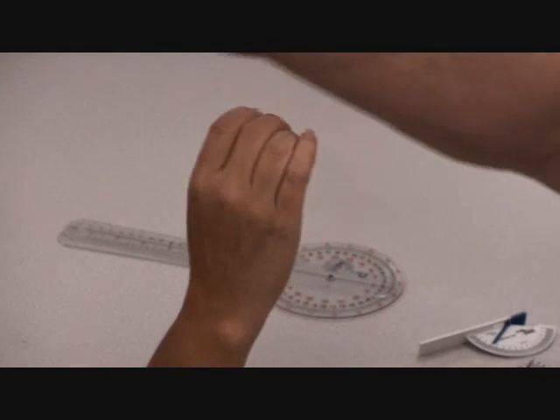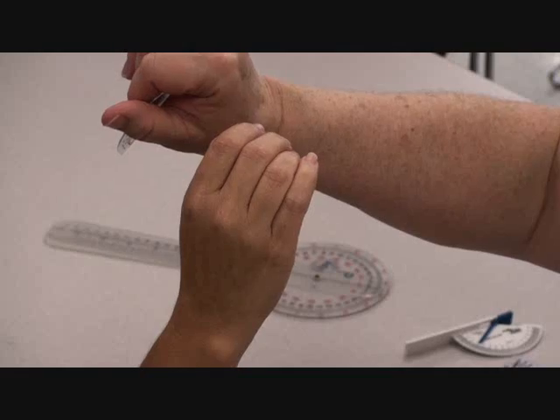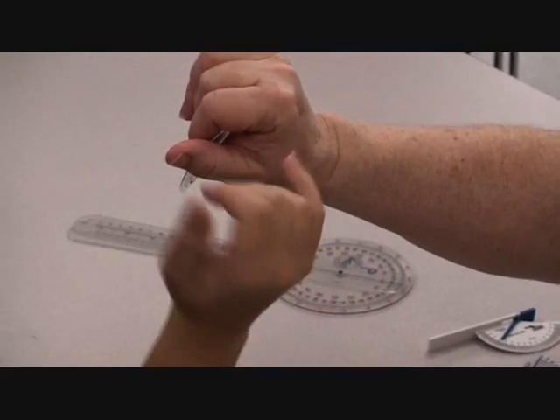But again, if we have something like that, you know, swan neck deformity, that we would need to actually measure.